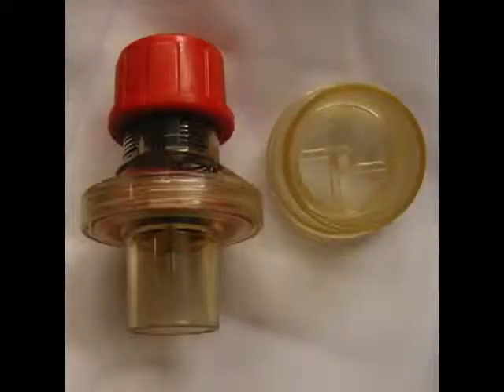And so the patient would exhale into this device, which you could dial in a level of CPAP or PEEP pressure, from 0 to, on this particular one, 10. You could dial it in, and so the patient would exhale against a diaphragm which had a spring behind it. And so by changing the tension on the spring, you were able to create a positive pressure which the patient had to exhale against.